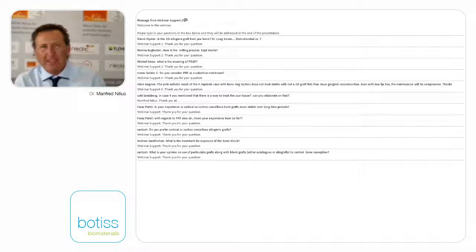You can do this when you make a 3D cone beam technology. Then you can look into the bone and you can measure the Hounsfield units. We normally do this after 6 months, but there is a rule coming from the Freiburg University, one third, two thirds. So two thirds autologous bone and one third beta-tricalcium phosphate, for example. And the mixture is very good. So I recommend this way, and I do this. I also do this mixing of different materials for having better radiological proof.